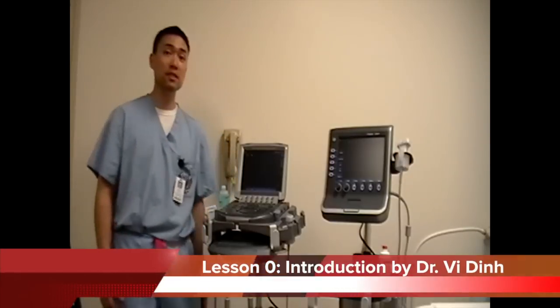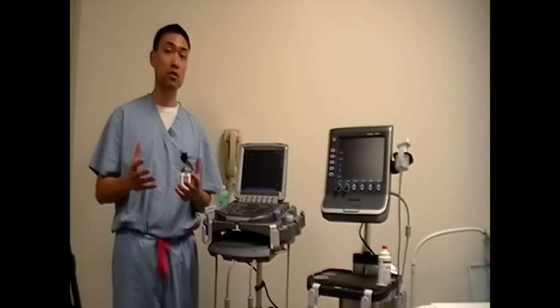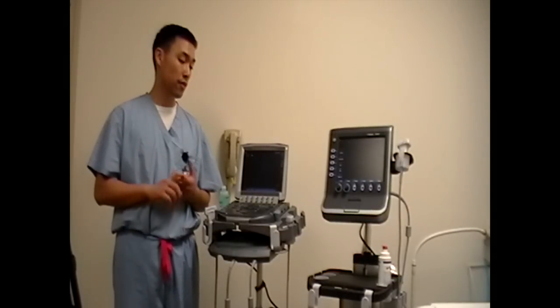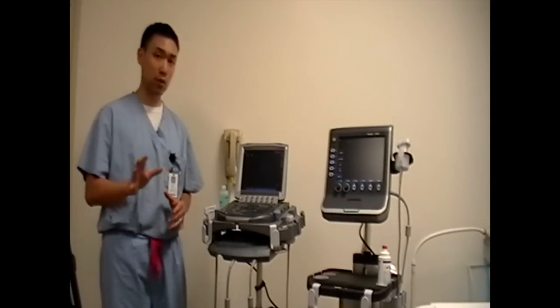Hi guys, my name is V. I'm one of the emergency medicine faculty. We're going to have a series of videos to teach first-year medical students how to use ultrasound. So the first video is just going to be an introduction to the machines. It's going to be a very laid-back video, so just pay attention and bear with me for a little bit.